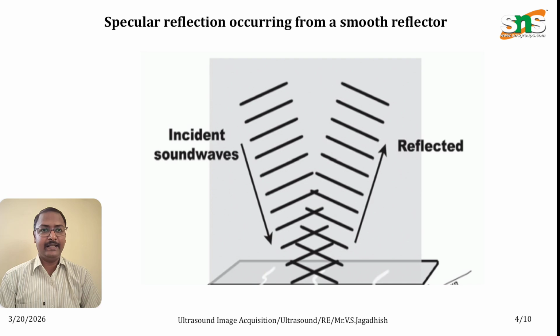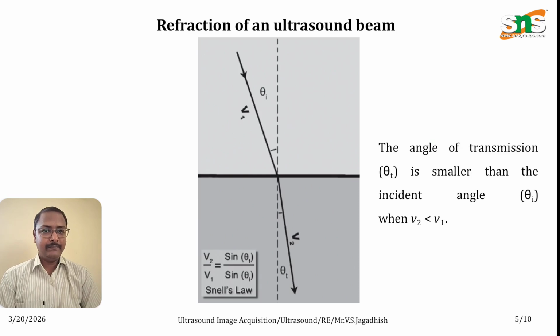This picture indicates that. Here we have a formula to calculate the incident, transmitted and reflected waveform. We call that Snell's law.